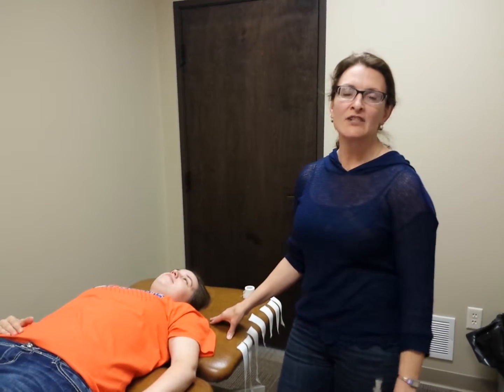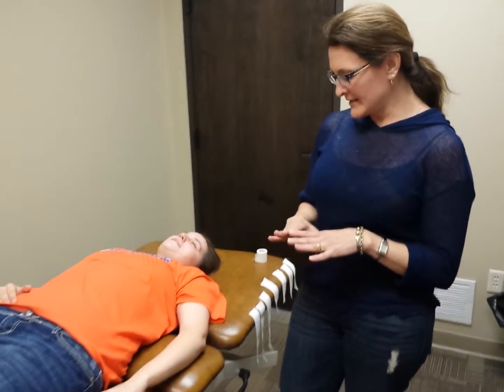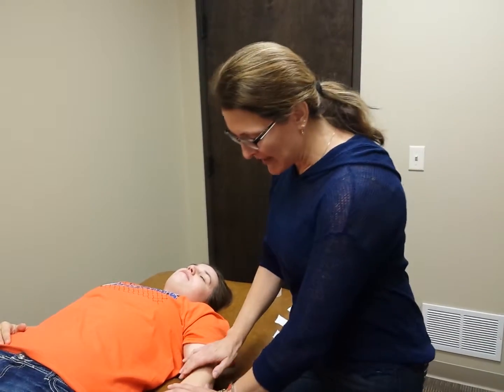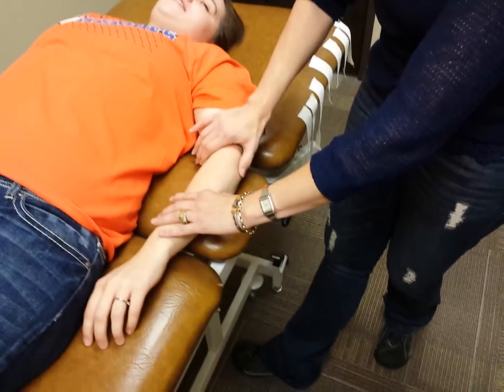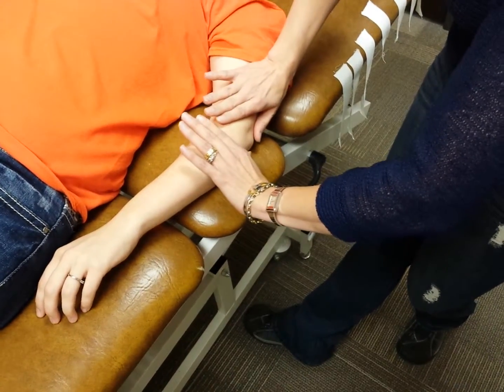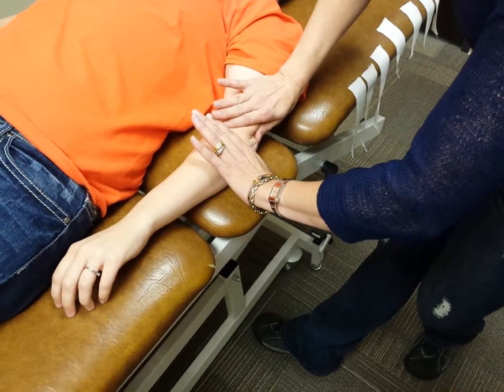I'm going to be demonstrating a diamond taping technique, and this is actually indicated for a person who has pain at the lateral epicondyle. What we're doing is taking the force away from that area, creating a healing environment for it.